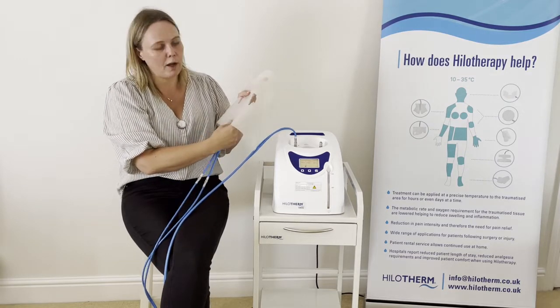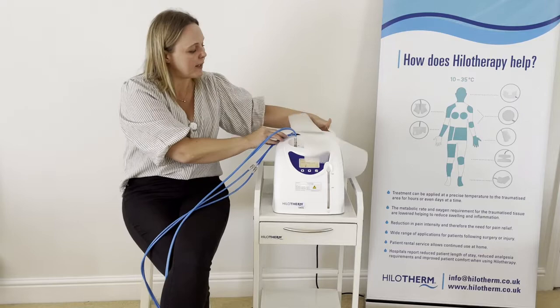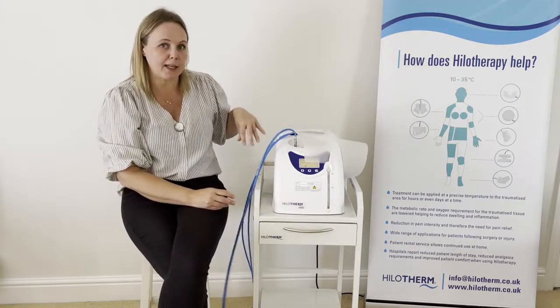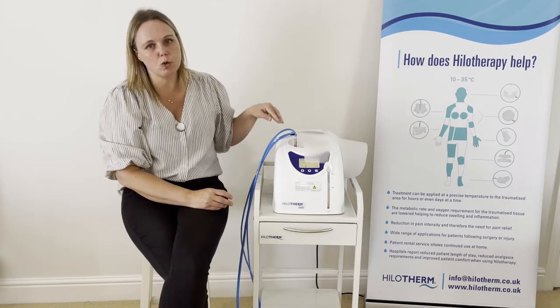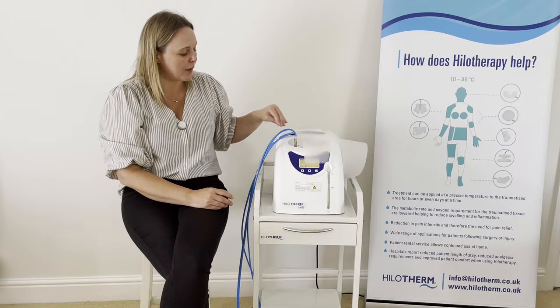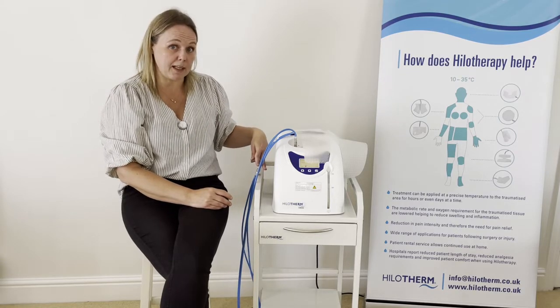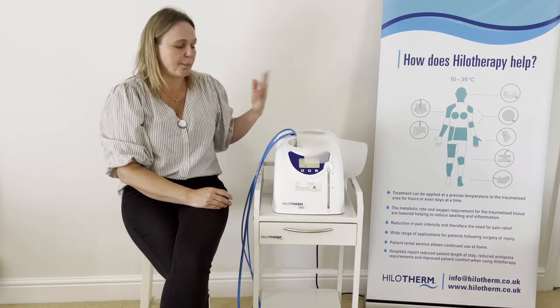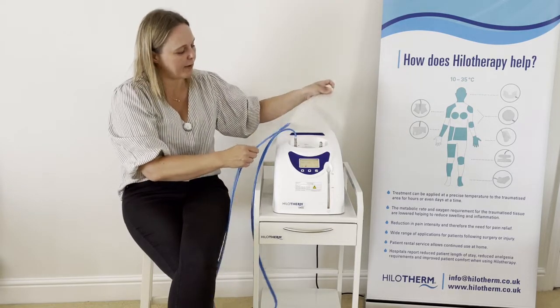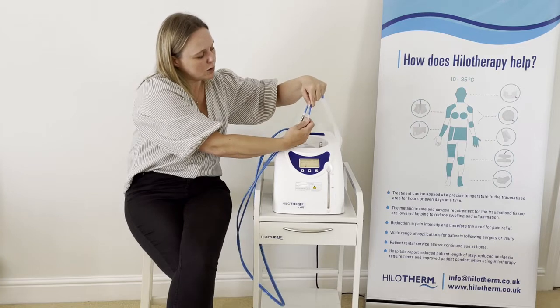When the patient is going home, I recommend leaving the flow stopped but everything still connected for at least 10 minutes, to allow as much water as possible to drain back into the machine. There will probably still be some that leaks out, but that is certainly a better approach. Let the patient take the cuff home with them.